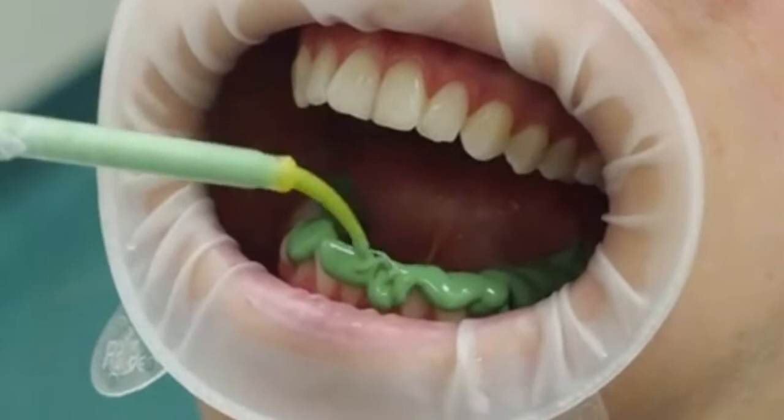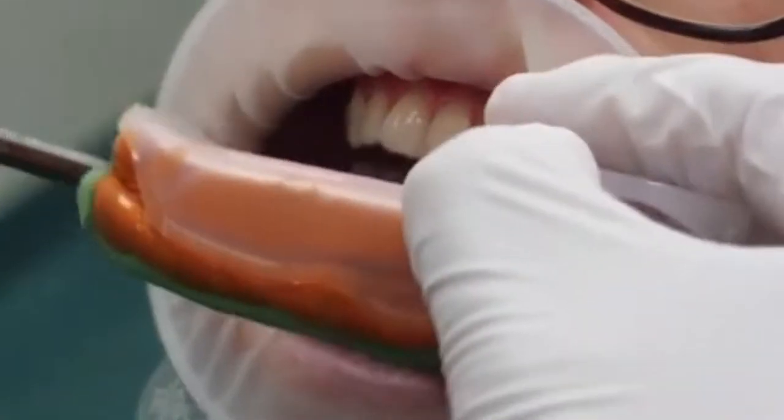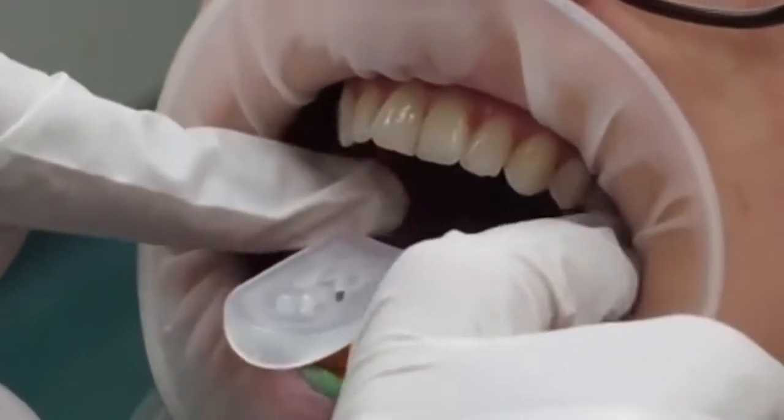Inject all the way down into all those fissures, up to the back teeth. Use lots of light body — the light body will get displaced and there won't be much left, but you need a lot to capture all those fine details.